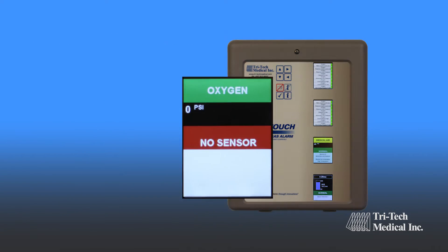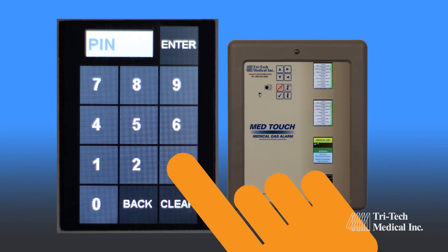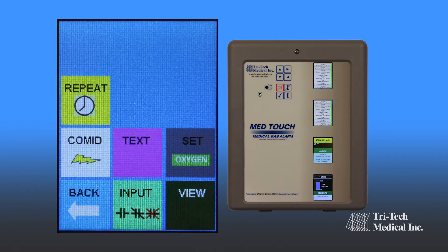Self-diagnostic error messages are displayed for ease of maintenance, with simplified programming through simple icon and question and answer choices.